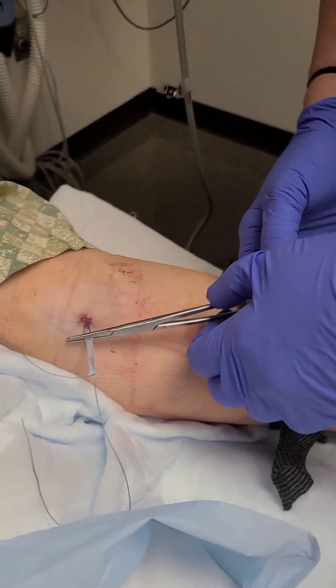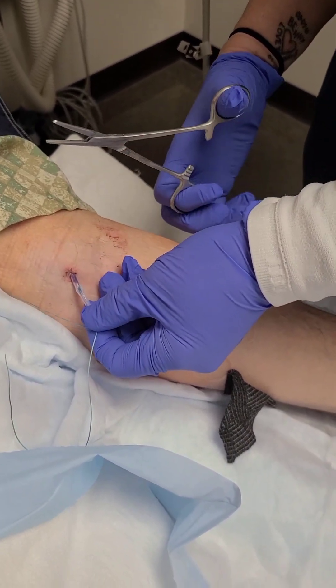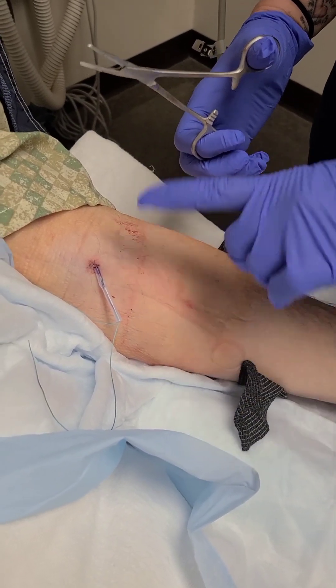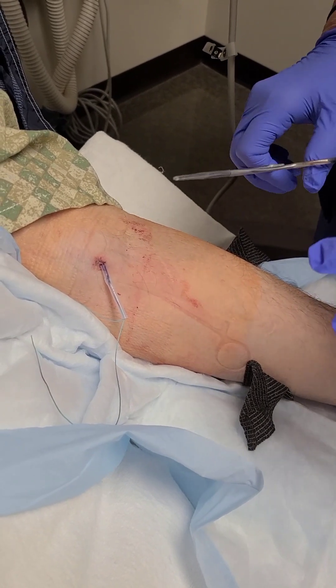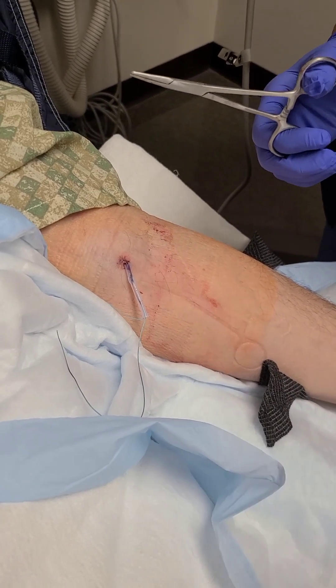I'm going to be careful. I'm going to release the pressure, so I undo the hemostat. Just let it be. Watch it for a couple minutes — just make sure that you're not going to get any oozing or leaking. If it has bled, you have some blood out.